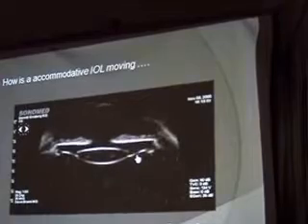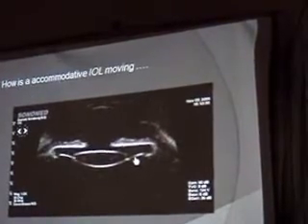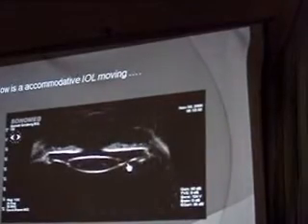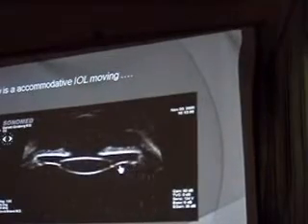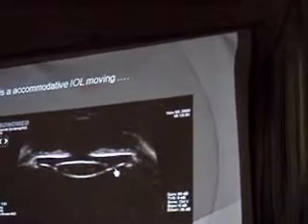And as you can see, the lens is moving backwards instead of moving forward. Means it's going opposite to all the effect we are looking for. When the pupil closes, which is supposed to be part of the triad, miosis, convergence, and ciliary body contraction, the lens is moving backward.